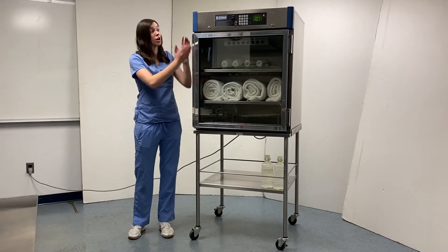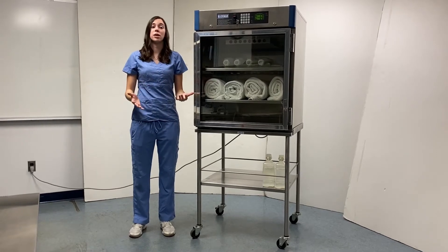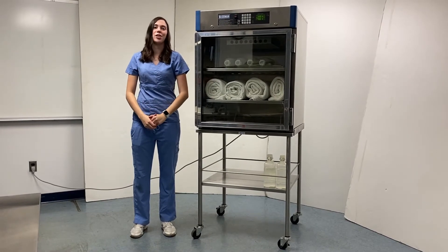This warming cabinet features our current controller system featured up top. If you'd like to learn more about the controller, feel free to check out our other videos specifically on that matter.